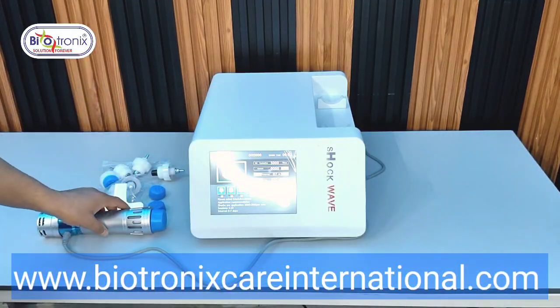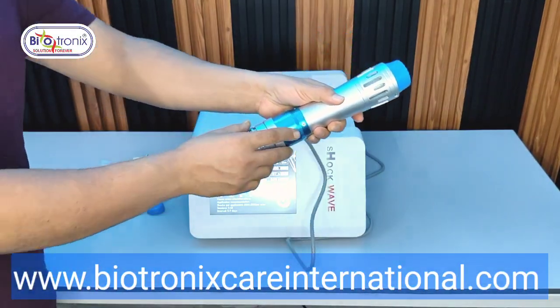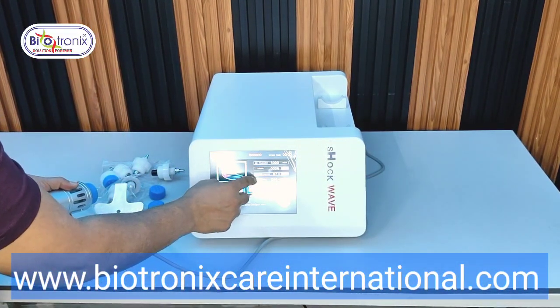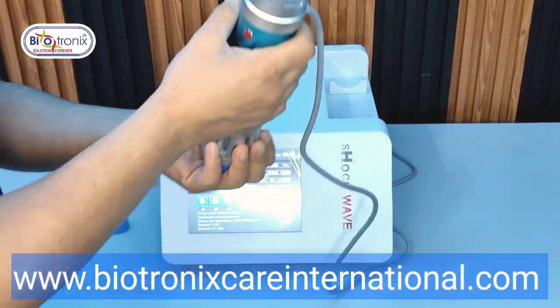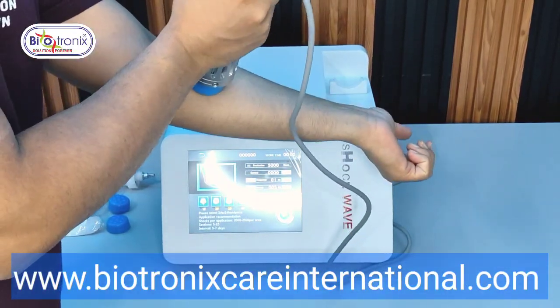Or if you want to stop in between, you can press that button, or you have the hand switch in the probe itself. This is a hand switch. So now I will show you the demo of the device. I'm putting the intensity energy at the minimum and frequency at the minimum. So now you can see I'm using the same on this joint area.